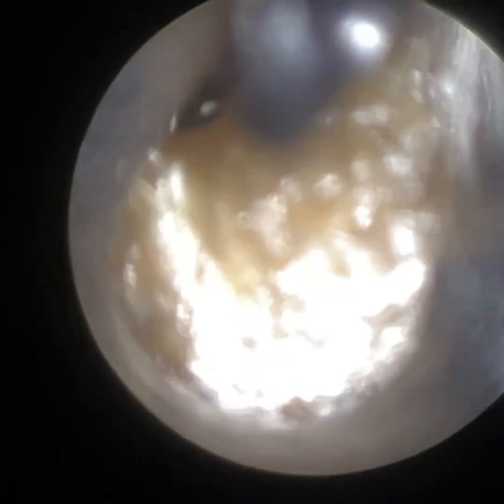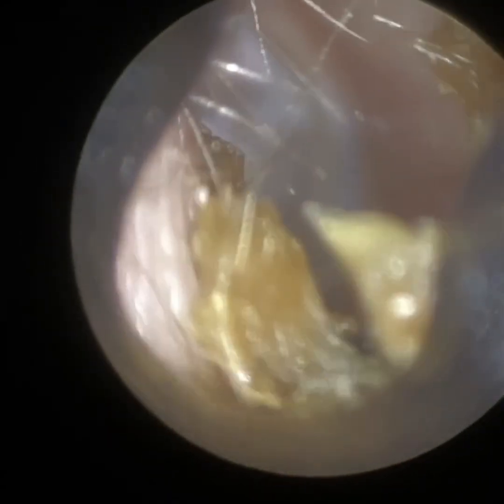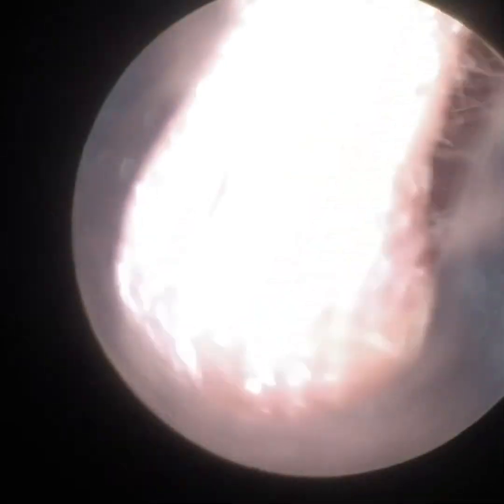So we have a patient here, we're in their left ear. I've just reduced the brightness slightly because this wax is quite glossy and it's reflecting the light. I'm just using a Jobson horn. There was an opening at the roof of the ear canal, so we're just using the Jobson horn here to slowly and gently scoop out this very sticky, thick keratin and wax, and it came out in a single large plug.